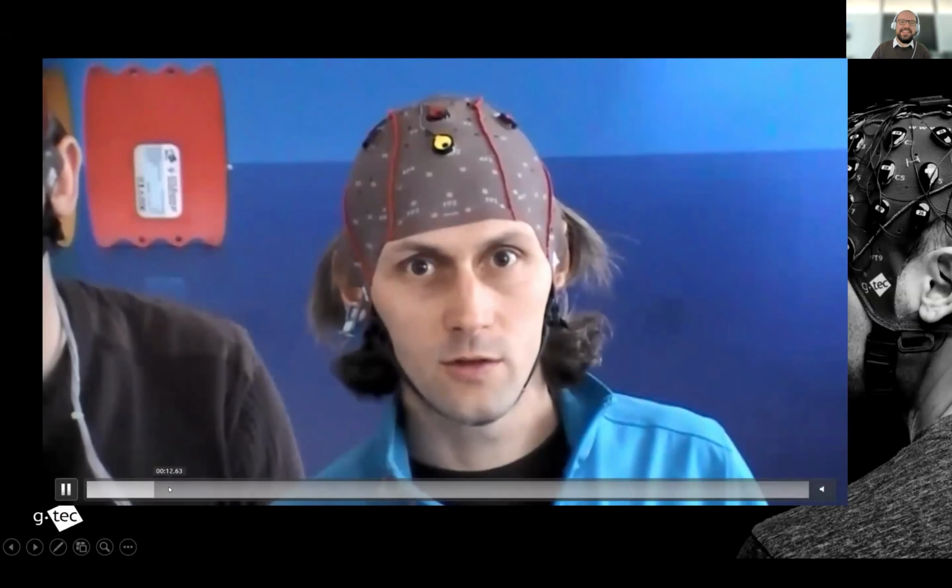So we were using, in this case, 4 USB amps, so 8 channels per USB amp, and people were trying to select together all the same characters, so they knew which characters they wanted to select because they wanted to write Merry Xmas. And this was a very successful experiment that we did.